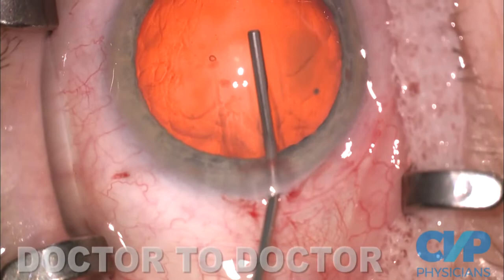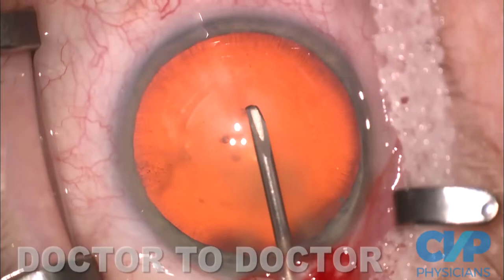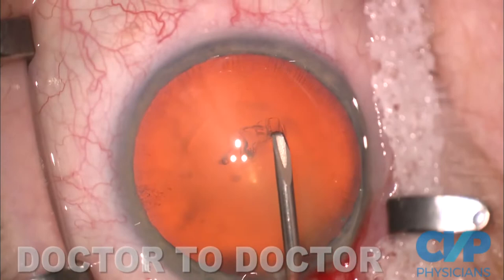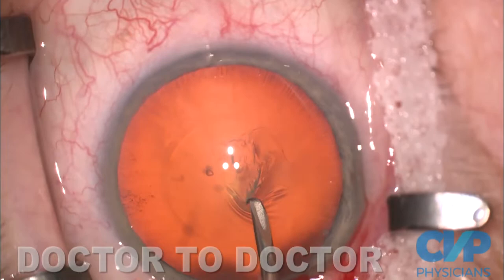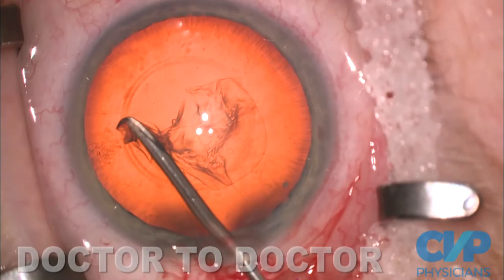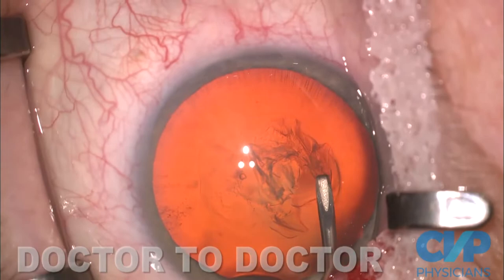Helon 5 is my OVD of choice. I'll put an imprint on the cornea for my capsulorhexis. I have always made the capsulorhexis with a needle. This is a safety rhexis technique where I basically turn one of the edges around, so I always have a second chance — although I never use it. I make a very slow rhexis. When you go through Helon 5, it's hard to be too fast, at least with a needle. The capsular guide gives me the same size rhexis pretty much every time, so the edges cover the optic. I always finish outside the starting point.